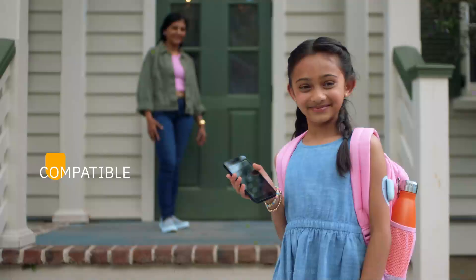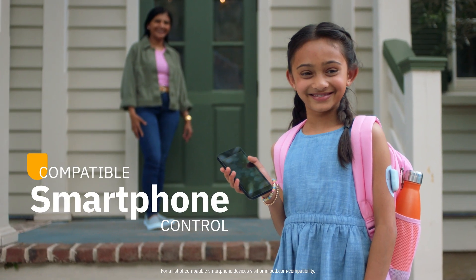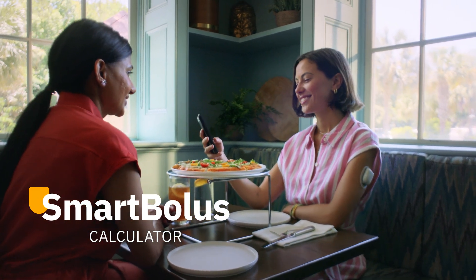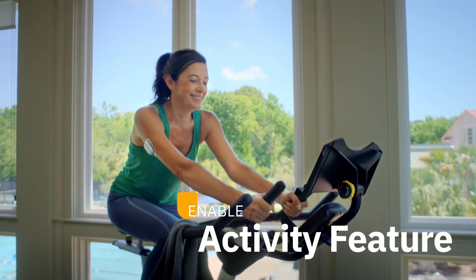Even better, everything can be controlled from a compatible smartphone. The Omnipod 5 app features helpful tools like the Smart Bolus Calculator for Meals and the Activity Feature for Exercise.